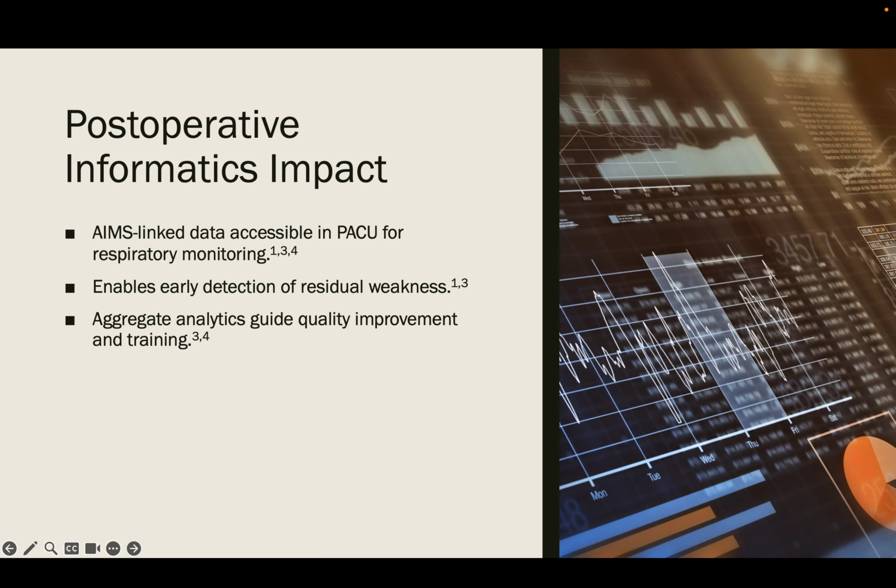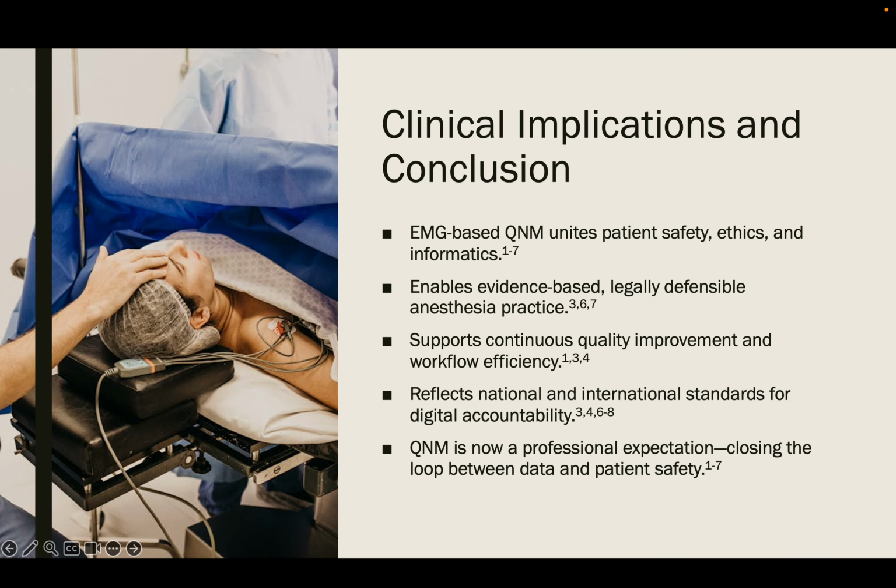In the post-operative setting, AIMS linked quantitative data enables PACU staff to view real-time train of 4 values and reversal timing, allowing for focused respiratory assessments and early detection of weakness. Aggregate analytics from these systems help identify performance trends, track adherence to extubation standards, and guide ongoing education initiatives.